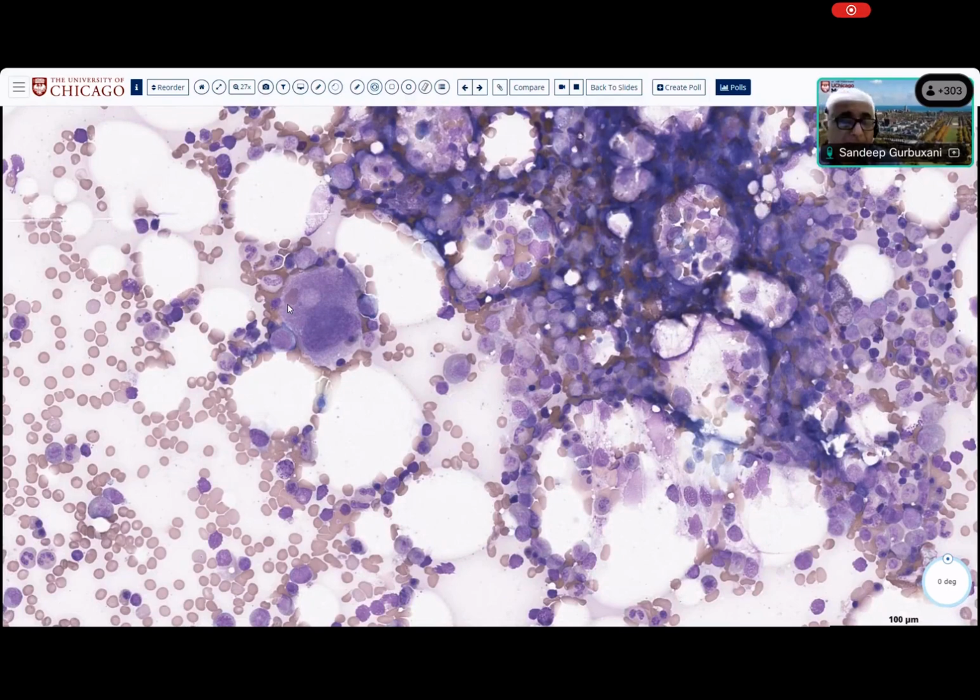And this should be distinguished from phenomena like hemophagocytosis, where the cell that is chewing up the live cells and destroying them is a histiocyte or a macrophage. So unlike that, this is emperipolesis, where the intact cells are just sitting inside the cytoplasm of this megakaryocyte. Excellent observation.